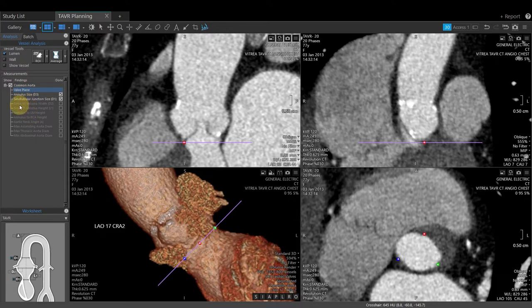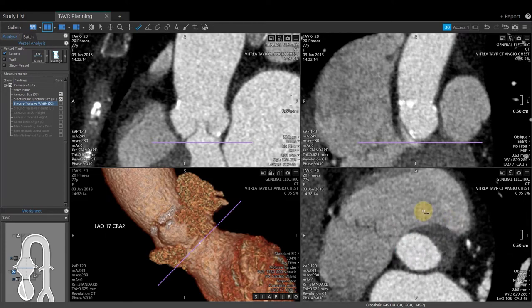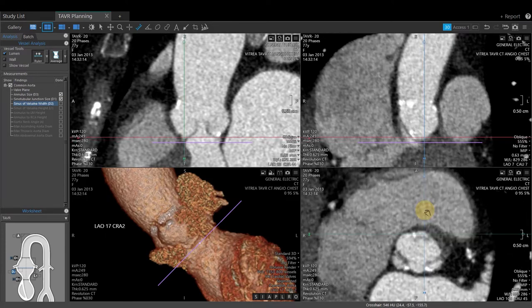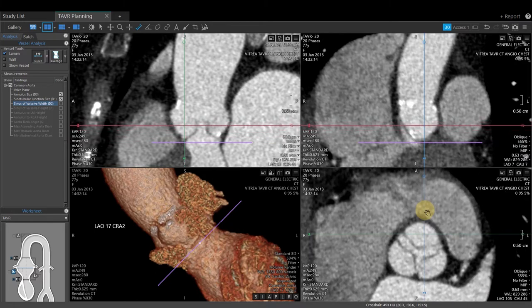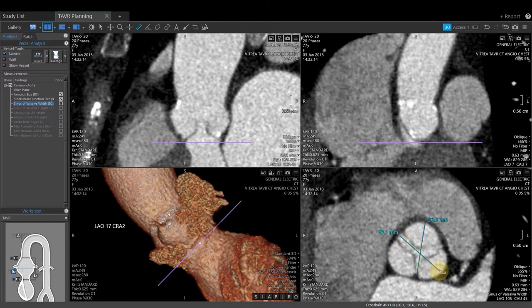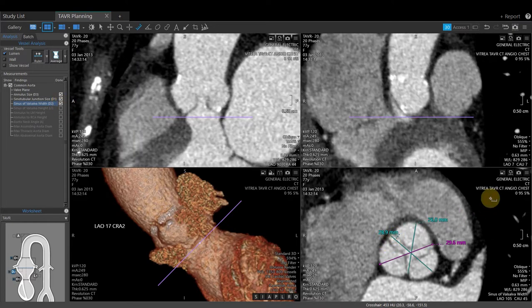Next is the sinus of Valsalva width. Left-click to select this measurement — note the ruler tool is activated automatically. Roll the center wheel and hold down the left ALT key for the reference crosshair lines if needed. Once at the sinus of Valsalva, left-click and drag to create the measurement. Edit the ruler tools as needed by hovering over the start or end point. Click Done and save by clicking the snapshot.